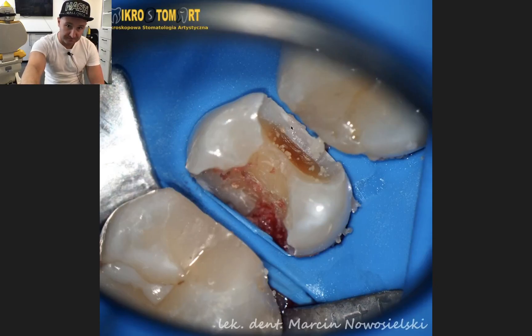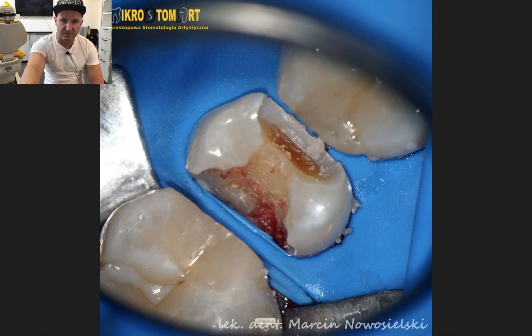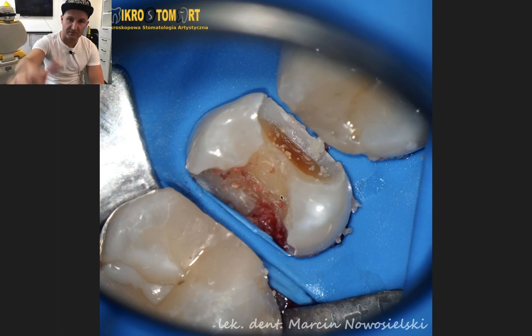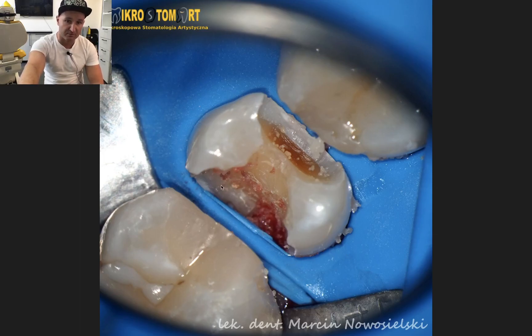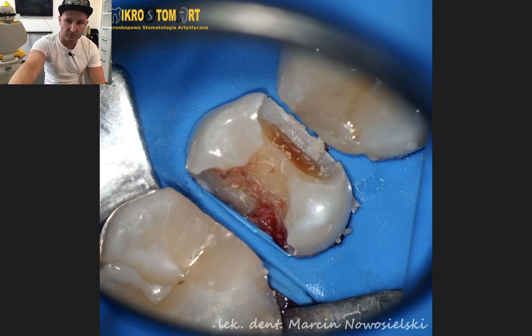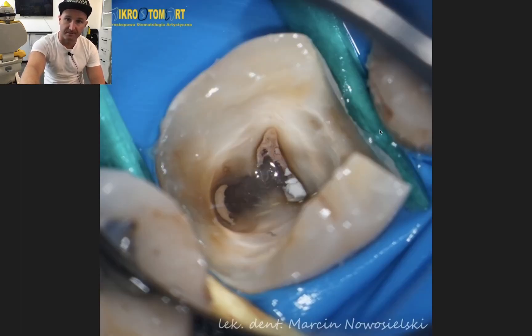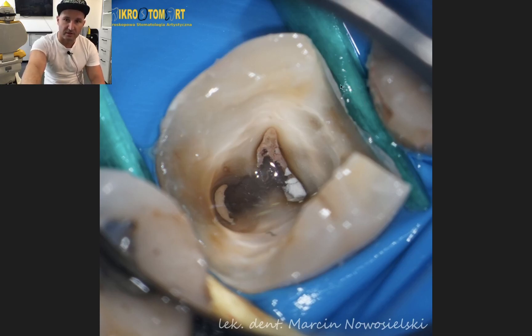After that, we place the rubber dam. Always in such cases, I isolate adjacent teeth — one tooth distally and one tooth mesially — and the clamp is always on the tooth distally. Sometimes when necessary we have to place a clamp on the tooth we are working on, but not in this case. As you can see, we had some problems with isolation here because the rubber didn't want to go underneath the cavity margin.